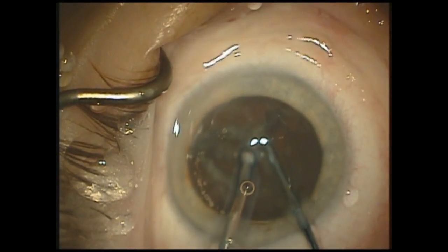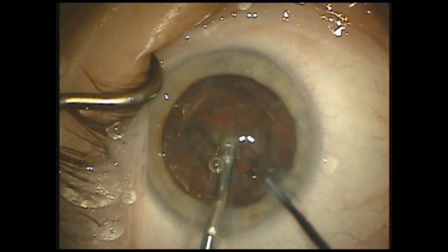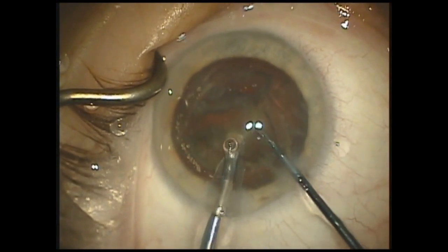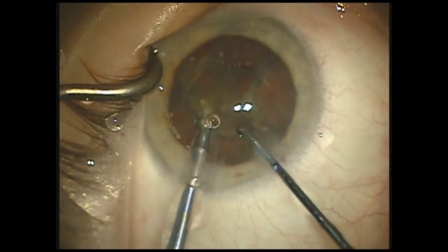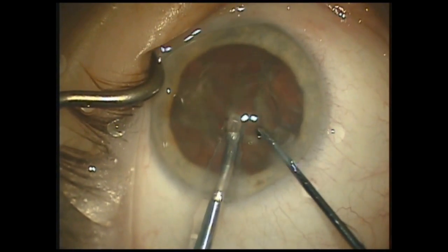As the phaco needle is buried into the hemi nucleus, I will engage the dual linear system to hold onto the nucleus with 400 millimeters of vacuum, holding a firm grip for chopping. After the nucleus is chopped, I'll stay in the yaw position to easily pull the quadrant out and up into the central safety zone.